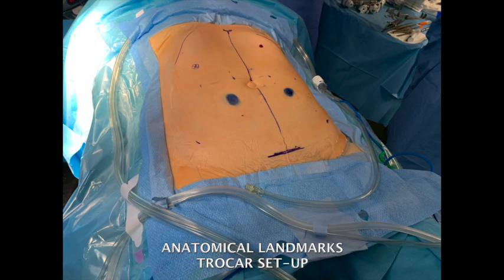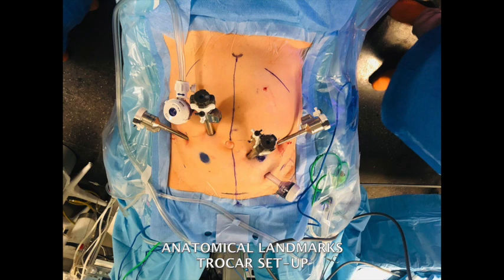Two 8mm robotic ports plus two 12mm robotic ports are used. Two 12mm assistant ports are added to the robotic ones. Port positioning is as shown in the figure. A continuous high-volume pneumoperitoneum system is used to ensure stability throughout the procedure.